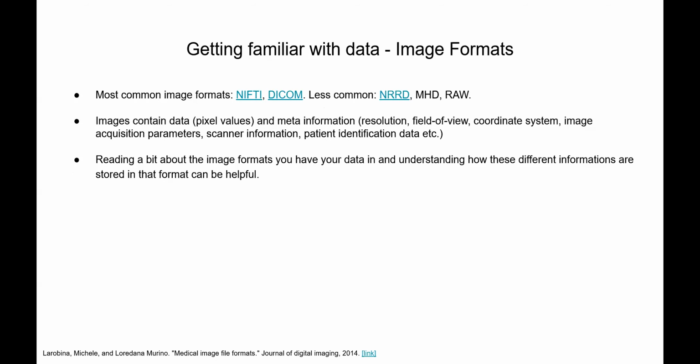Right. So one thing that people have to get used to a bit if they're new to medical imaging is that data is in different formats. Typically we have NIfTI or DICOM, but there are also some less common formats. And we just have to get used to how to read and write data from these formats.